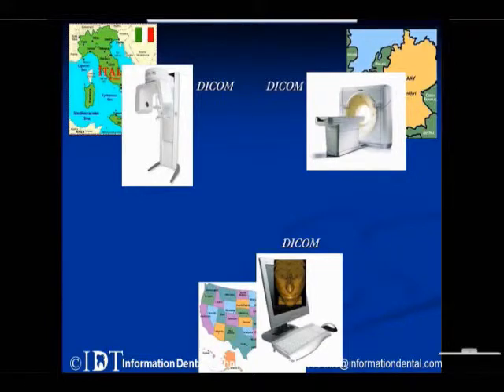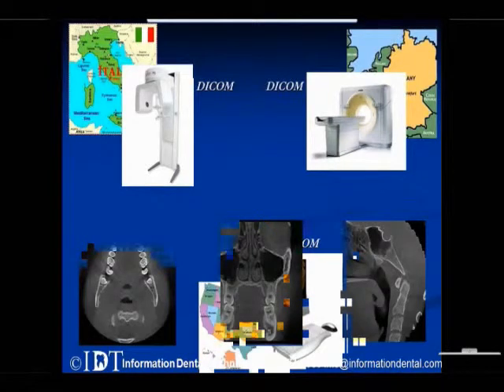So when you're requesting a Dicom scan or the Dicom images, series of Dicom images from your scan center or from your technician, what you're saying is, I want the image of the patient in a universal language that I can use in any platform. So that's basically Dicom. It does mean that you're getting the scan and you're getting the volume of the patient. It's just a universal language.